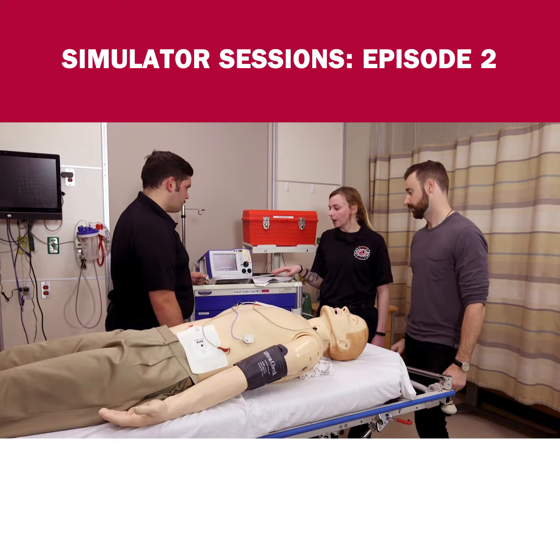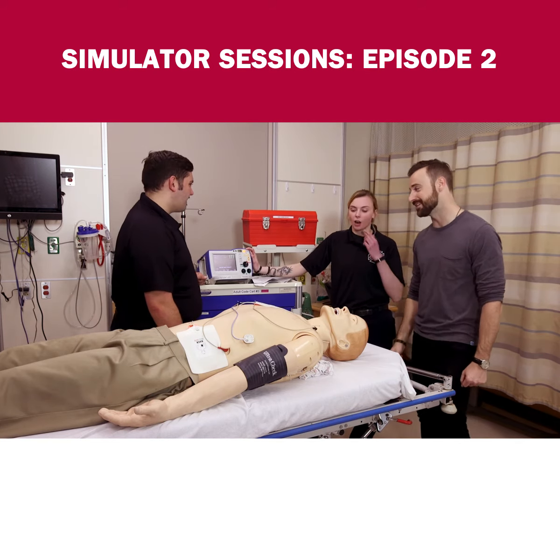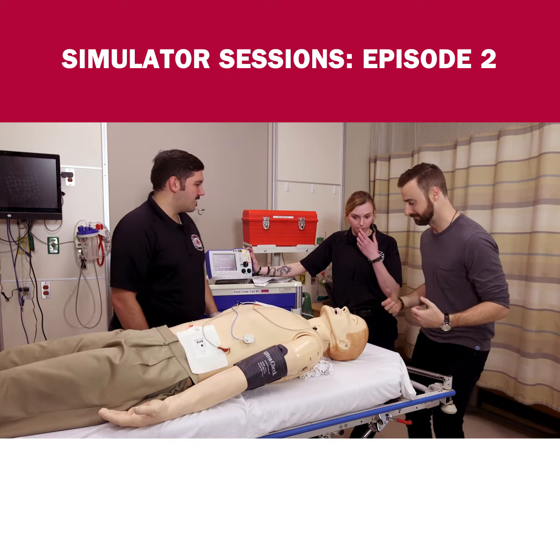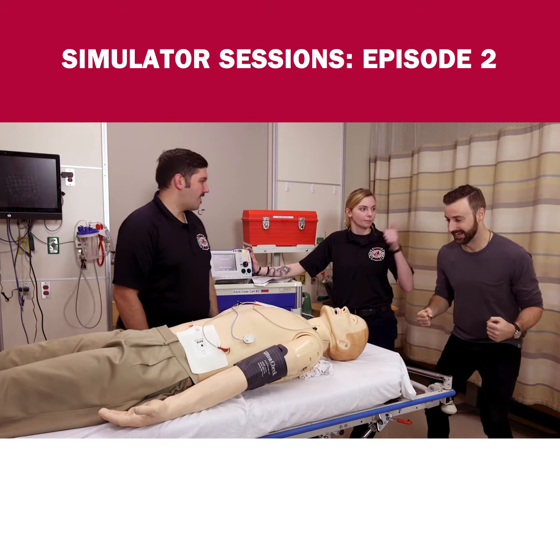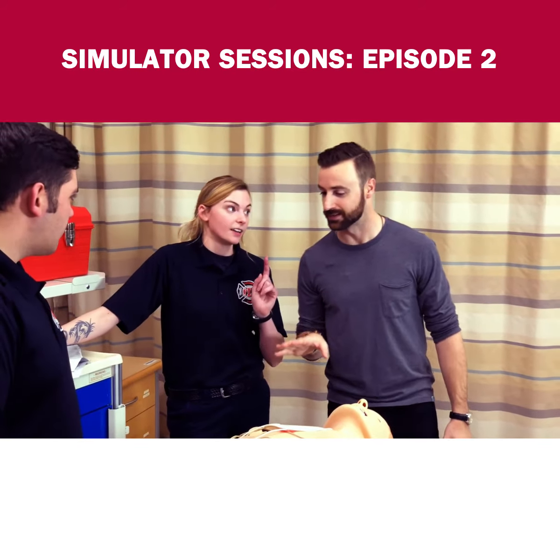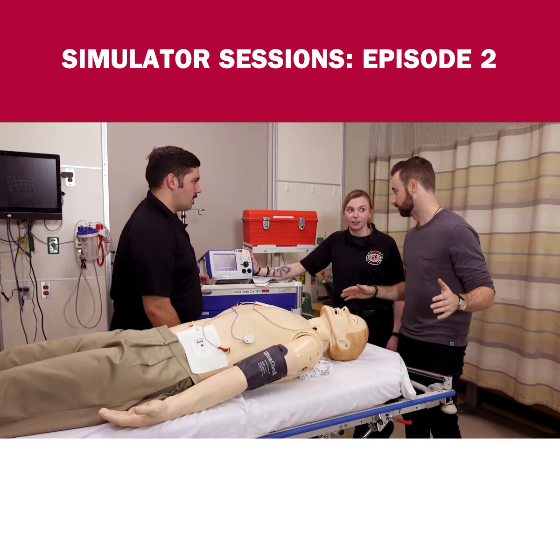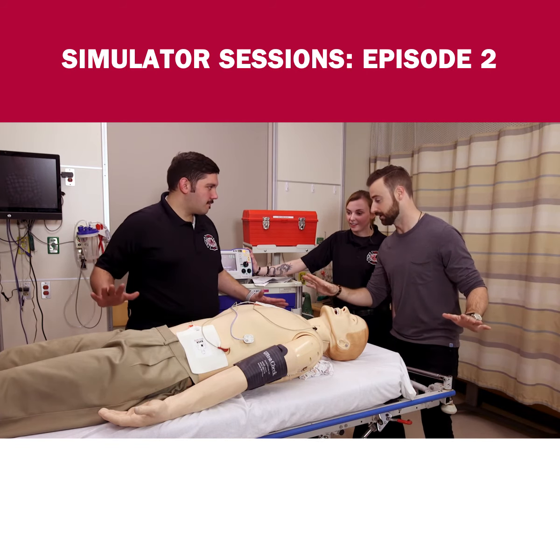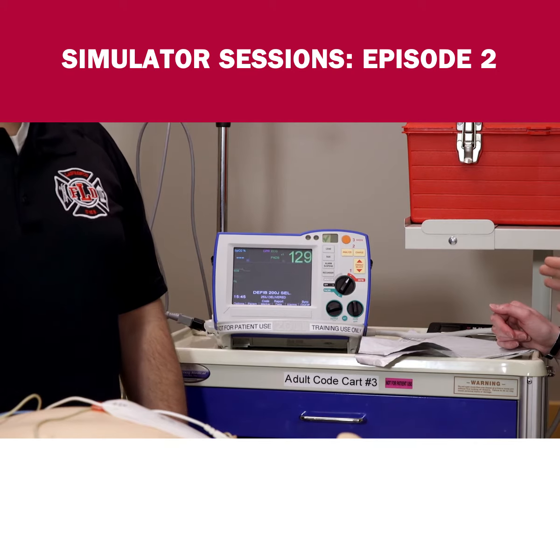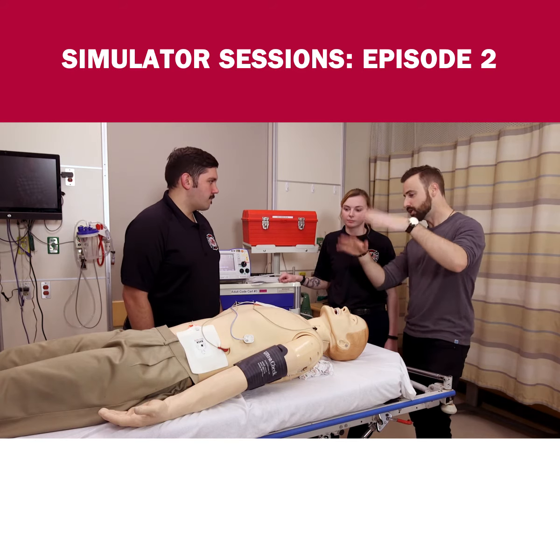The joules is basically how much electrical energy we're putting in — 200 joules sounds like a lot, and it's a good number. I see that red button — it's a very red button. But before you hit it, you have to make sure that nobody is touching the patient. So you get to yell 'clear,' make sure no one's touching, pull your best Clooney, and then you hit that button. Ready? Clear! And good — look at that, hearts beating again.